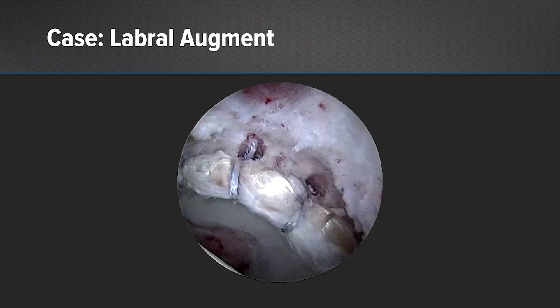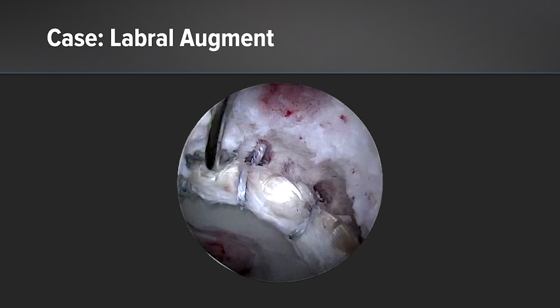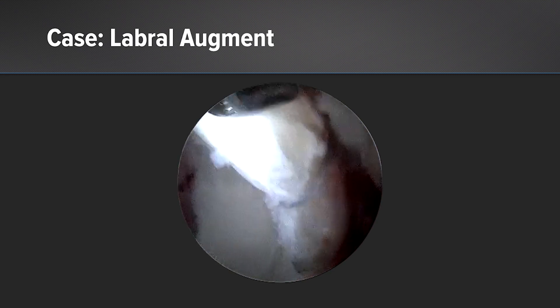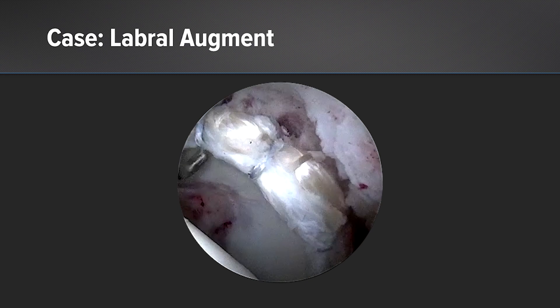Here's a bird's eye view on video to show you some of the 3.0 knotless suture tack anchors and how the graft sits in a hybrid model where the graft sits behind or on top of the native tissue, preserving the chondrolabral junction.